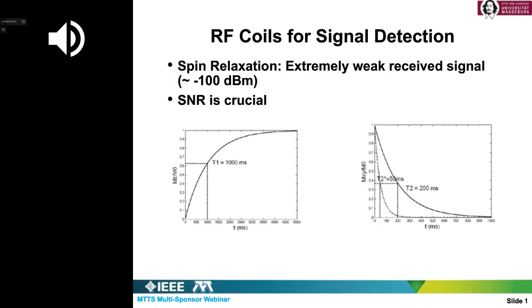Okay, this was in the transmission scenario. Let us consider the receiving scenario. Because of these loss mechanisms, you need also high Q in order to catch the radiation before this T1 or T2 elapse.